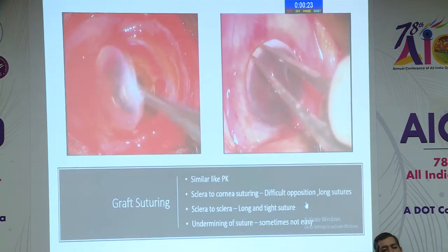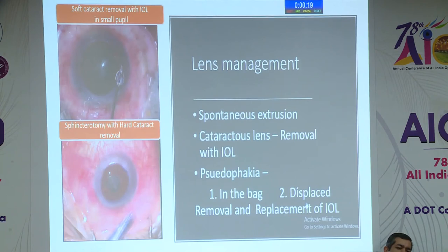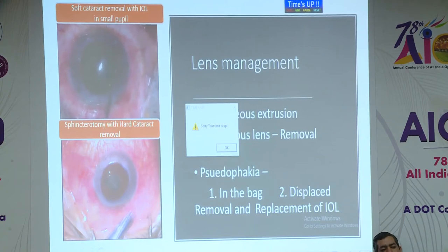During the surgery also, we face cataractous lenses, and we can manage them very easily by the small open sky technique. In soft cataract, we can do it without dilatation. These cases have small pupils, so without dilatation also we can manage them. But in hard cataract, we have to do a sphincterotomy.